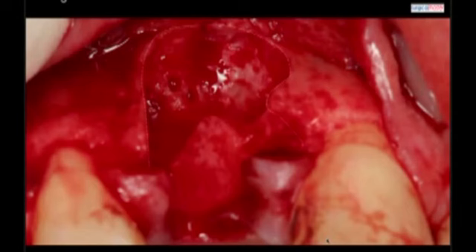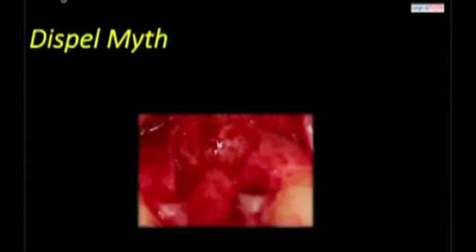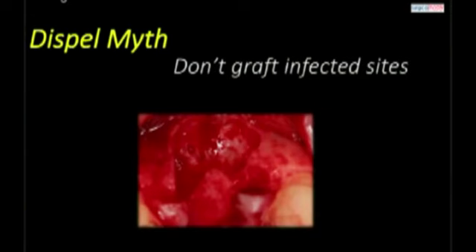The extent of the defect, what's next? Okay, and I think this is the time to dispel a myth. A lot of us are very concerned about grafting infected sites, and I was always of the opinion that you need to graft infected sites. Okay, so a myth is don't graft infected sites because your graft material will get infected. Actually, my opinion is this is the best time to graft.